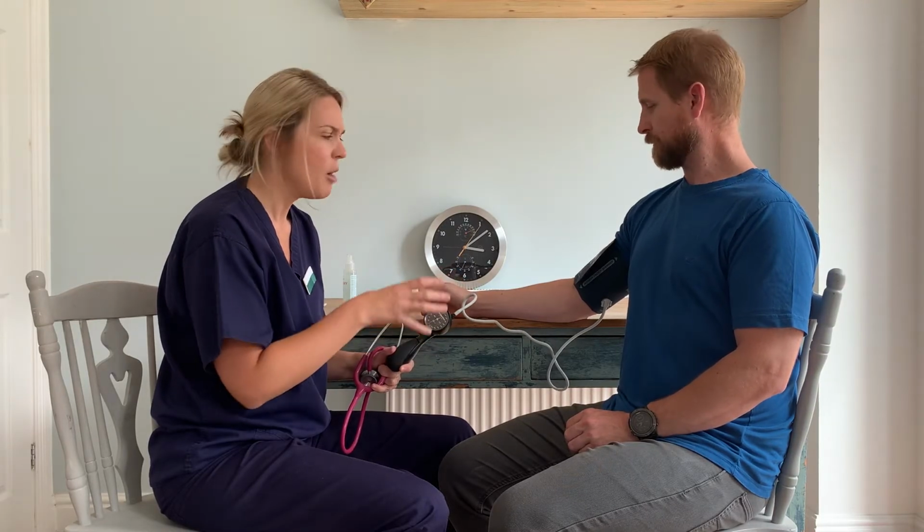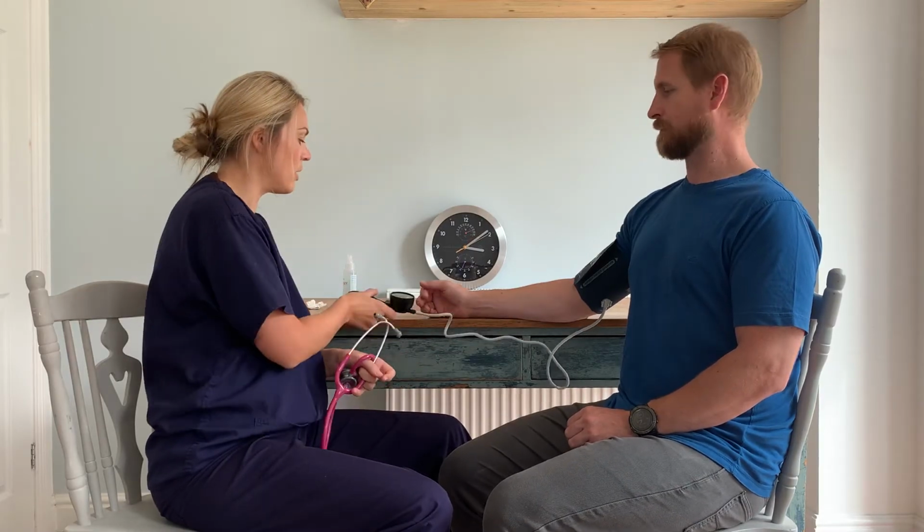If you don't estimate the blood pressure, you could have to pump the cuff up too high, causing unnecessary discomfort to your patient. Of course, if you know your patient well, if you've got recordings written down already that tell you what their blood pressure normally is, you might not need to do this. But for the purposes of the exam, this is how we want you to demonstrate taking your patient's blood pressure.